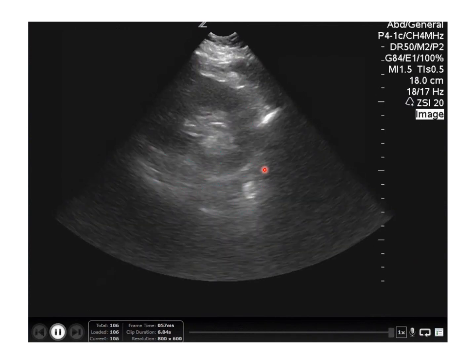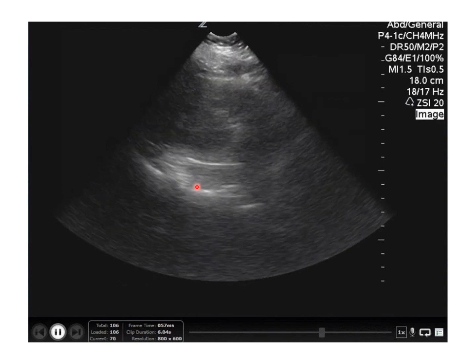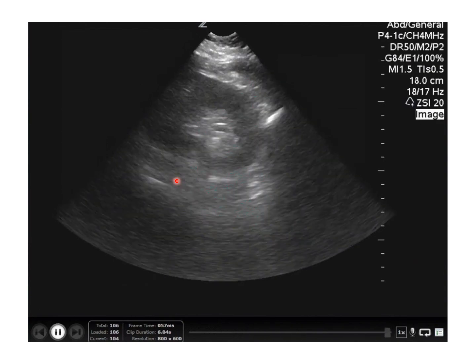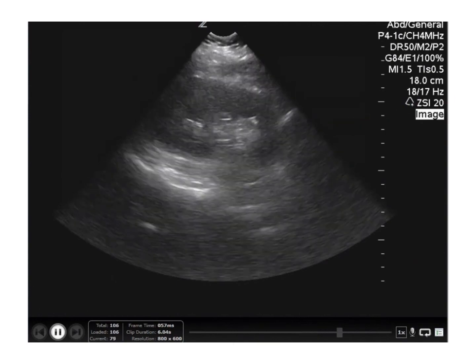No fluid at the inferior pole of the kidney. And no spine sign. The vertebrae stop here at the diaphragm. So it's a negative left upper quadrant.